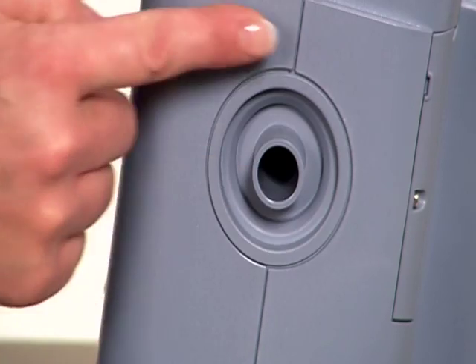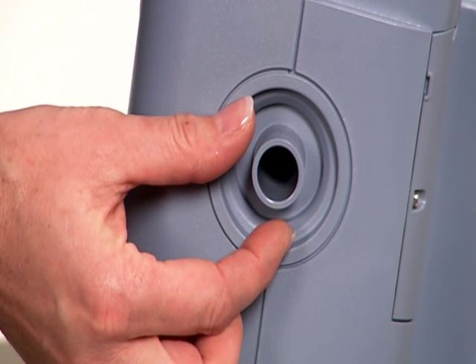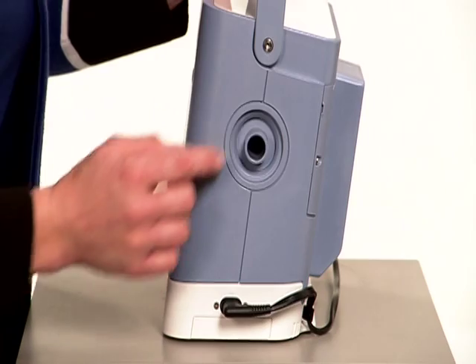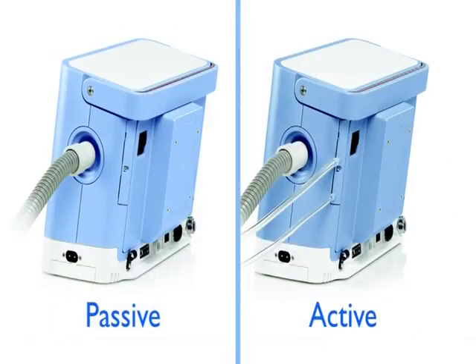The round opening above it is the breathing circuit connection. The tubing fits snugly onto the ventilator here. The device we're looking at now is fitted with a passive exhalation porting block, which is this piece in the back. If you're using an active exhalation porting block, your device will look like this with 2 additional connection ports.